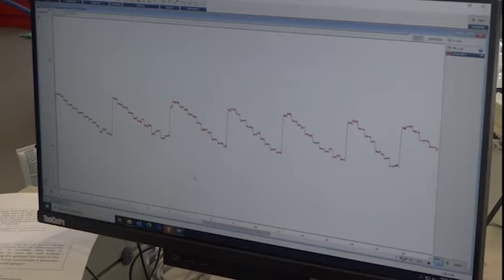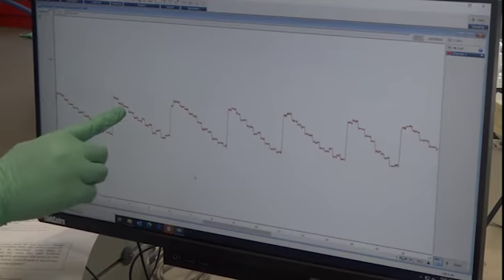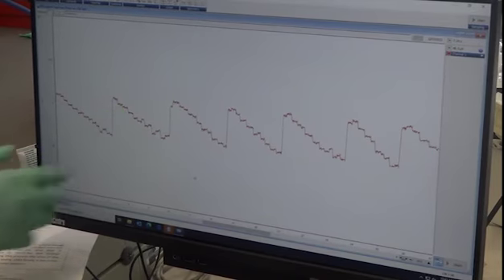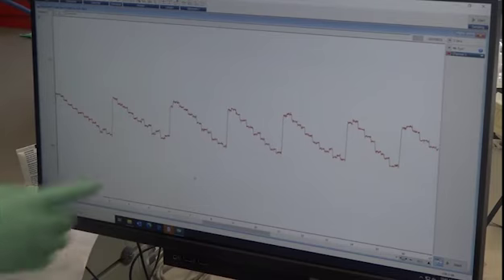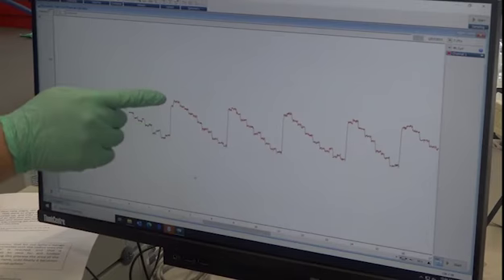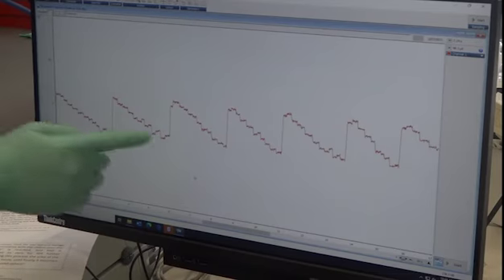So we're heading to the next word along the line. It'll then go flat as we focus on that word, and then negative as we shift to the next, and so forth, making a staircase-like pattern. That is until we need to change lines. That's what this very large positive deflection in the signal is. We've gone from the end of one line, looking all the way left to the start of the next.